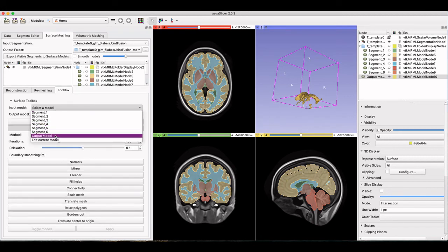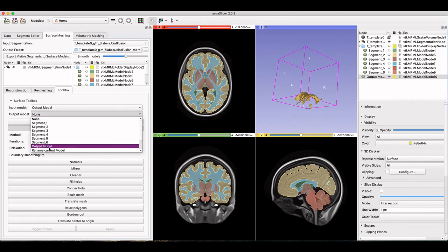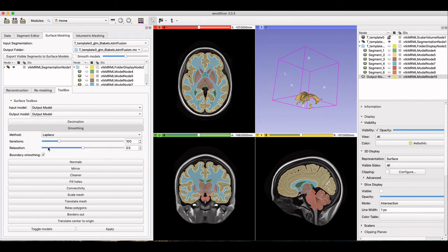Understanding how to use label maps is important to beginning the modeling process in many cases, so check back on this channel for more tips and tricks while using AvaSlicer.